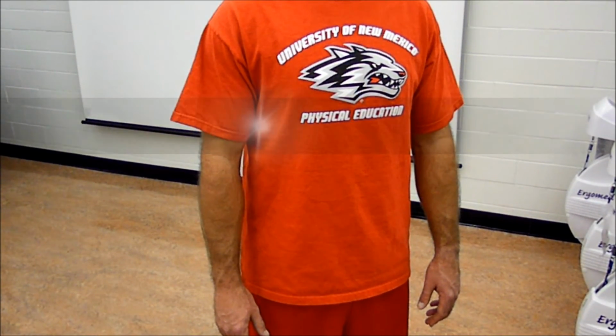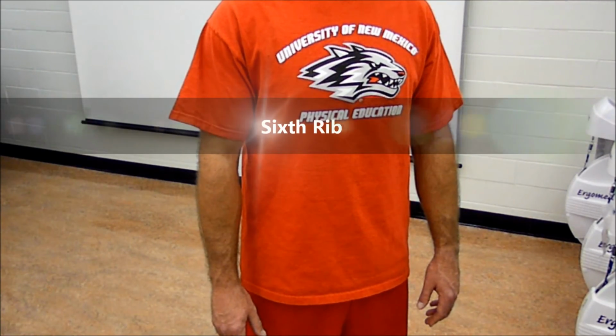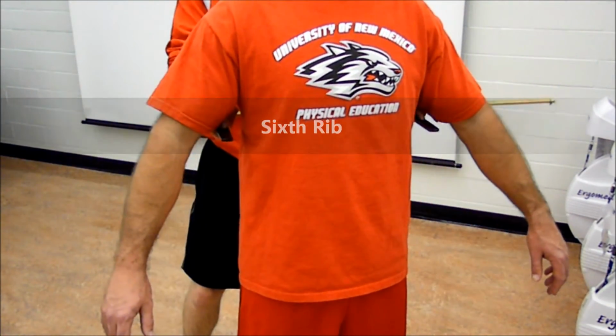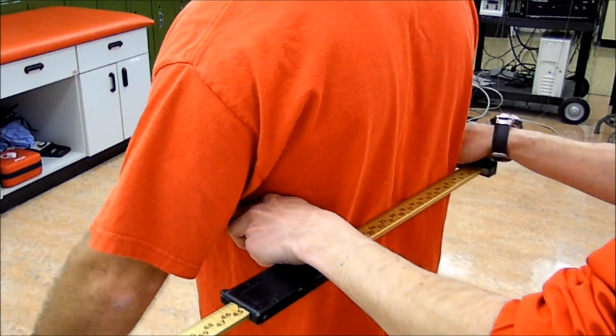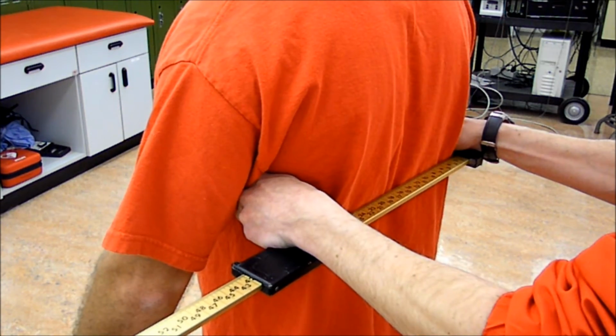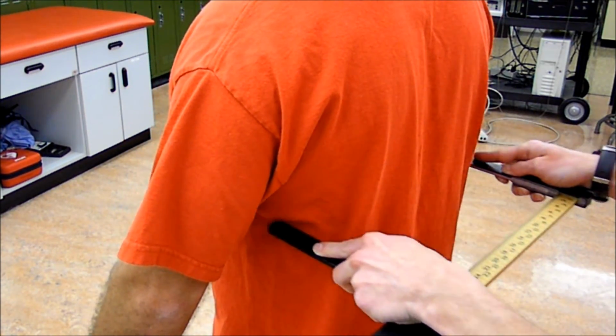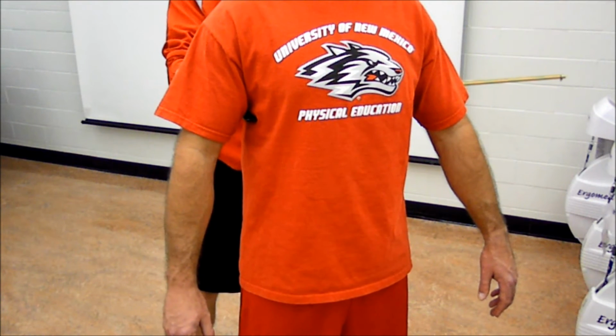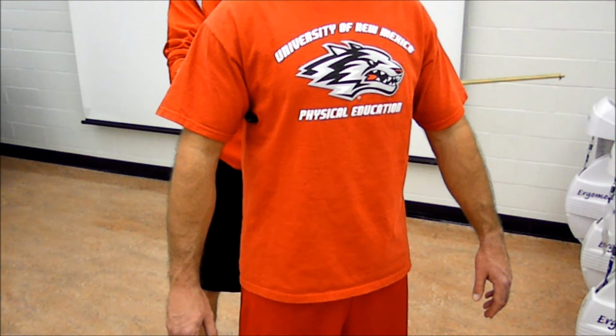The anatomical reference point for the chest skeletal diameter measurement is the sixth rib along the mid-axillary line. The participant should be standing upright with the arms slightly abducted away from the body. The caliper blades should be placed on the sixth rib of the mid-axillary line and the measurement value recorded after a normal expiration.